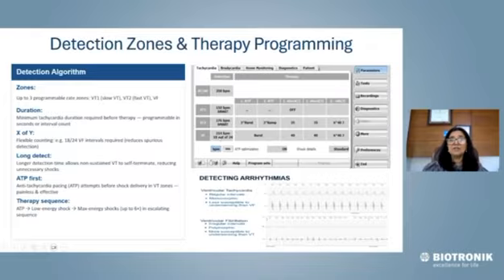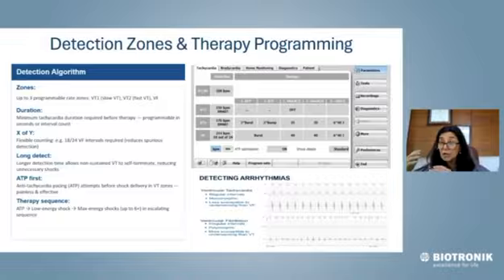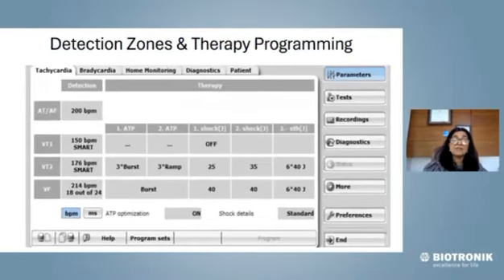Remember, in ventricular fibrillation, in the initial years, we did not have the ability to do anti-tachycardia pacing while the device was charging. Today, we have this unique ability because we have learned that sometimes even an ATP can help terminate very rapid VTs, which fall in the VF zone but are actually monomorphic VTs. However, if it fails, what do you want to do? You want to offer, in a VF zone, ideally the maximum energy available. There is no time to lose. When a patient is having ventricular fibrillation, you should offer the maximum joules that a device has the ability to charge and deliver. So that's how it works.